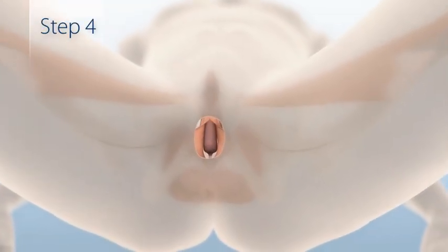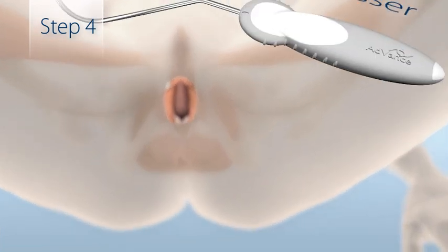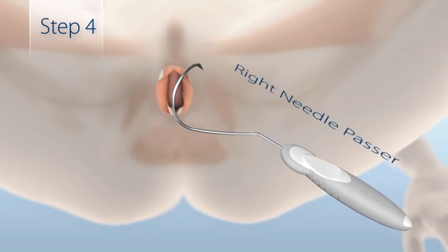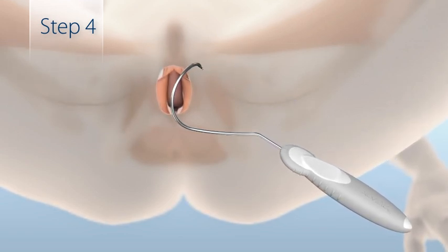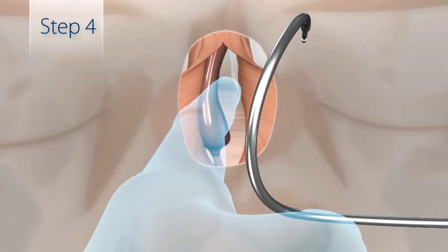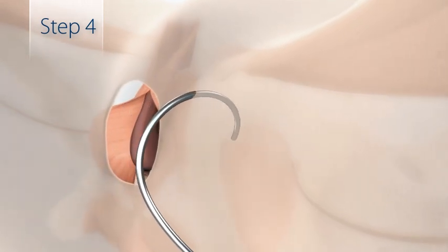The first step in sling placement is to insert the AdvanceXP needle passer. To insert, hold the needle passer at a 45-degree angle. Place a finger of the opposite hand into the perineal incision to receive the needle and protect the urethra. Insert the needle tip straight through the obturator foramen.